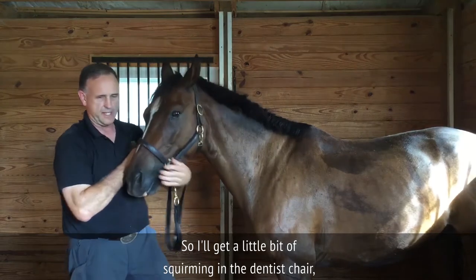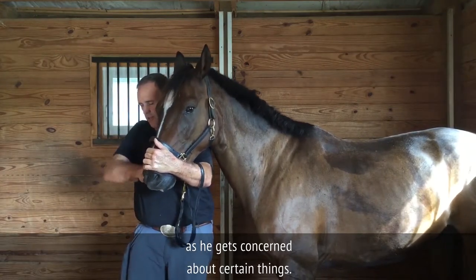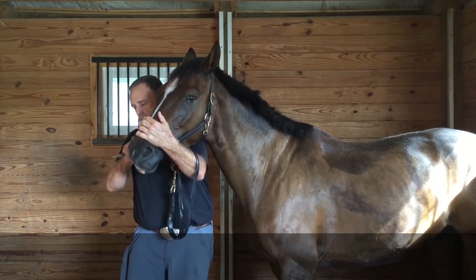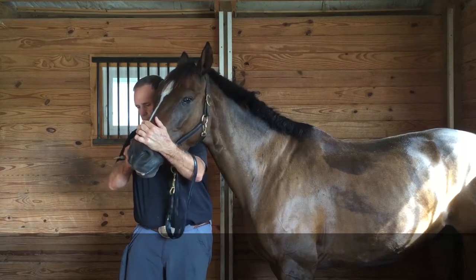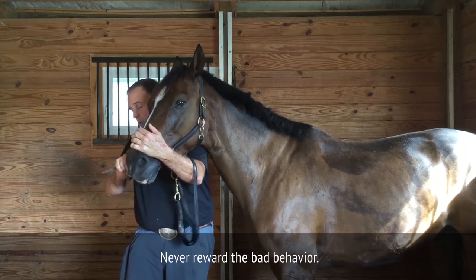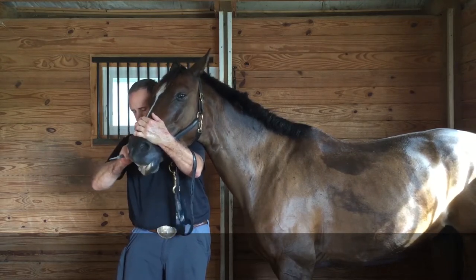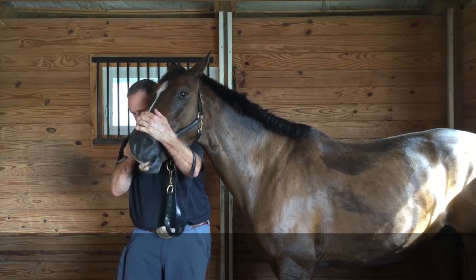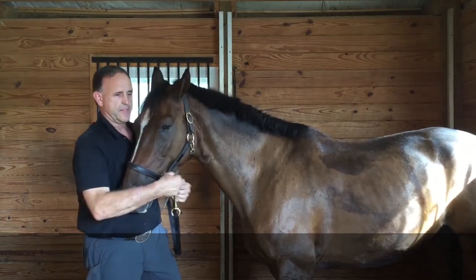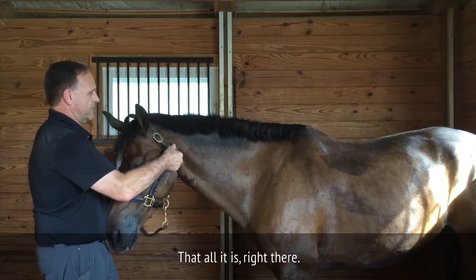I'll get a little bit of squirming in the dentist chair as he gets concerned about certain things. I'll put my hand on here to keep him close and intimate, so he knows that I'm with him. Never reward the bad behavior, but let me just tell him how good he is. Equine dentistry without trauma — horsemanship dentistry. That's all it is right there.